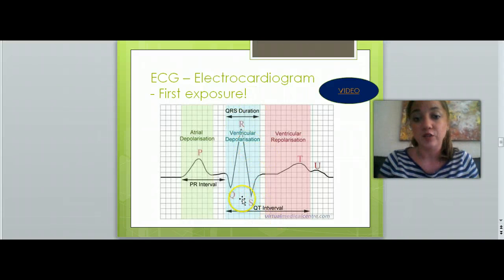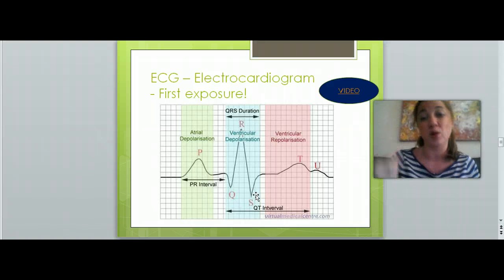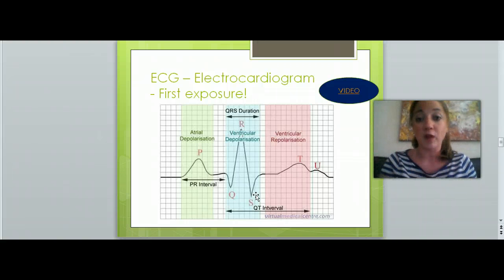Okay, so ventricular depolarization and ventricular systole are happening at the same time, which means ventricular depolarization is talking about the electrical impulse, and systole is talking about the actual action of the ventricle pushing out the blood into the next area, wherever it goes, whether it's right or left. From the right, it goes into the pulmonary arteries, into the lung. From the left, it goes through the aorta and out to the body. So that's what's happening right here in this mountain peak.